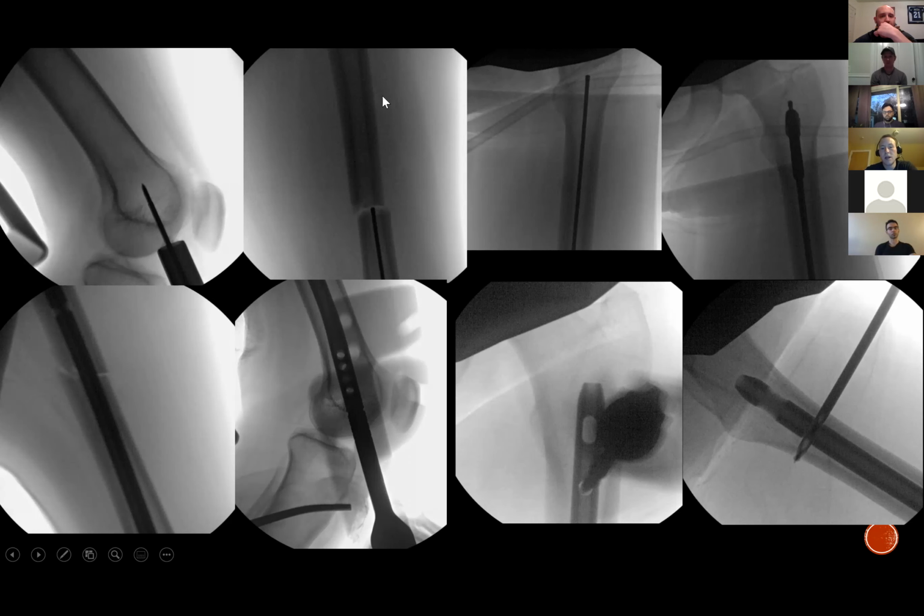And the new drills that we have, we use a Stryker 8. They have a lot of torque, and you can actually break a femoral shaft. So if your reamer is here in the wide open metaphysis, there's no chatter whatsoever. It's perfectly safe to stop the reamer, take an x-ray, whatever you need to do. But if you're feeling chatter, don't stop. You either keep going, or if there's a problem and you can't keep going, keep spinning, but back up a little bit.